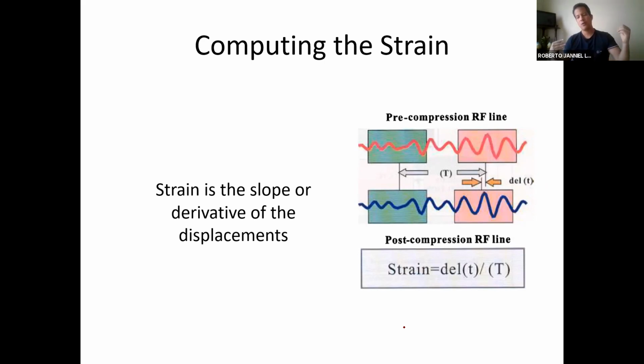You have flow, and a partial portion of the vessel that you're looking at, with some red blood cells. Then time passes, and a partially changed group of red blood cells gives you a speckle pattern that is similar but not quite the same. Here it's the same thing: because you're compressing and things are moving to the sides, the particles that generate the speckle are not exactly the same. They're similar, but not quite the same, which gives you decorrelation in the data.